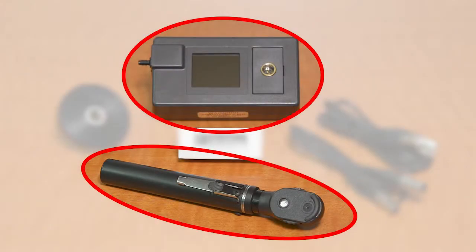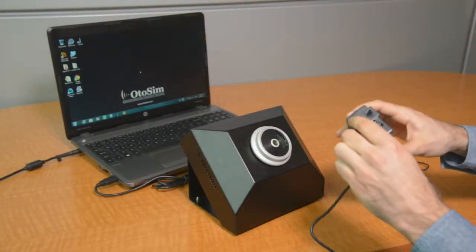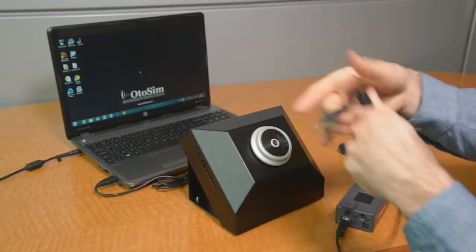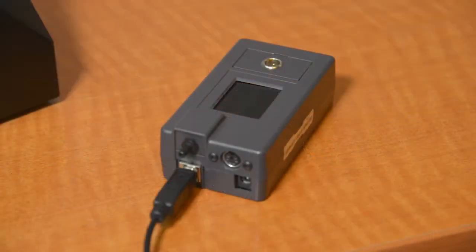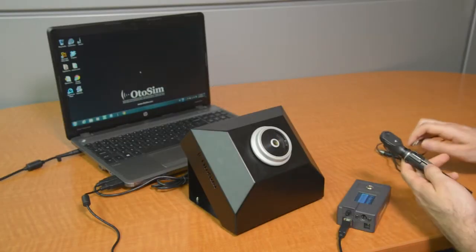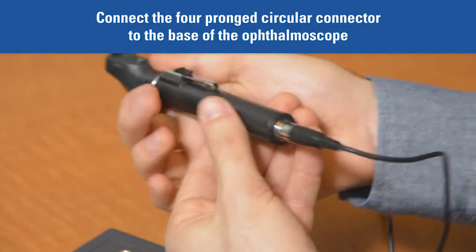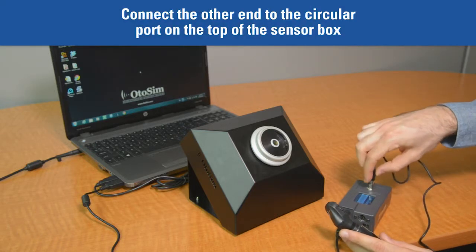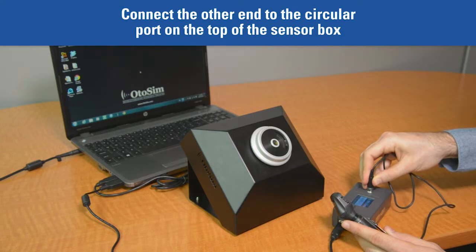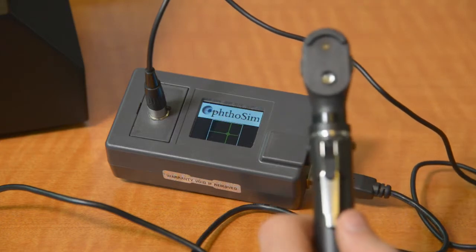Next, let's connect the sensor box and ophthalmoscope together. The OphtoSim sensor box is designed to be used only with the OphtoSim ophthalmoscope. Begin by connecting the remaining USB cable to the sensor box, and then into a second USB port on the computer. When first powered up, the display window of the sensor box will light up and show the OtoSim and OphtoSim logos. To connect the OphtoSim sensor box to the provided ophthalmoscope, first connect the four-pronged circular cable to the bottom of the ophthalmoscope. Connect the other end of the cable to the circular port at the top of the OphtoSim sensor box.